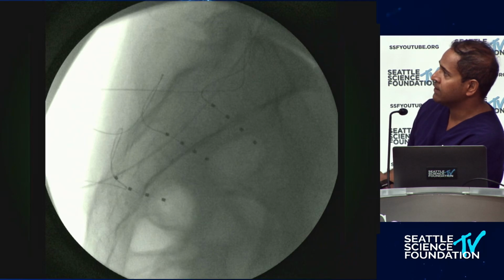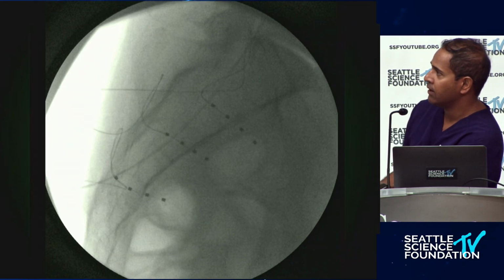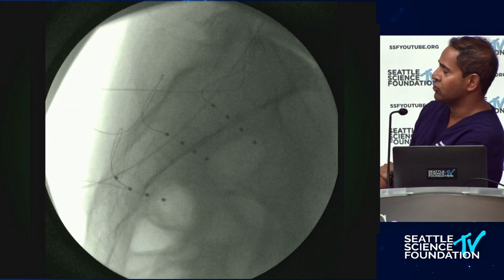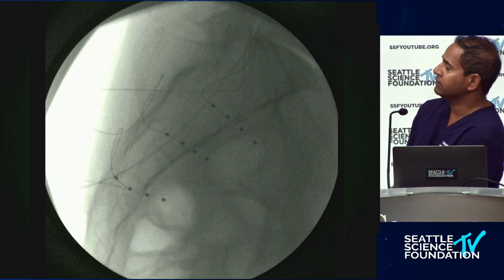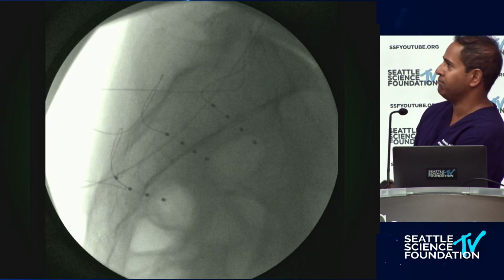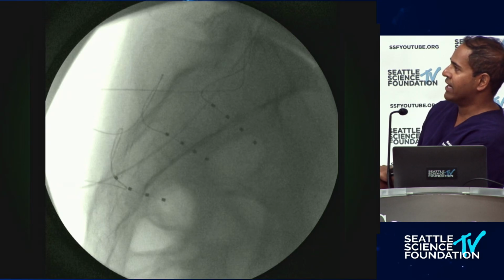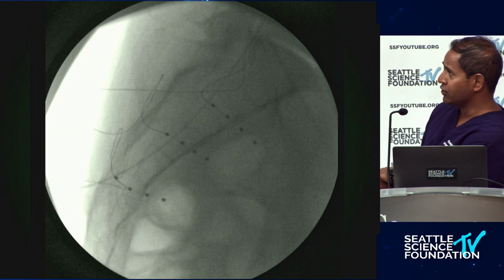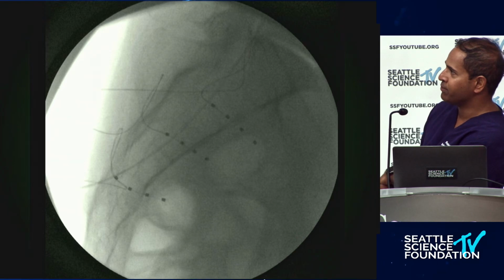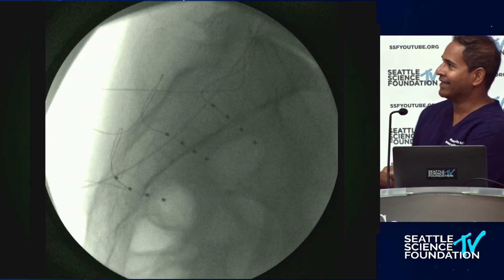This shows you sacral placement. This was a patient who had severe pelvic pain, hadn't had sex in 30 plus years, and couldn't wear underwear because of allodynia. But after her DRG implant, she's having sex and wearing pants, underwear, you name it, riding motorcycles. So this was a great case, one of my first cases. You can see here, this is an extrasacral loop. This is something that I've been doing if I can't get my loops within the sacral epidural space. Dr. Mehta has also been doing this. We call it the sloop, or the extrasacral loop technique.